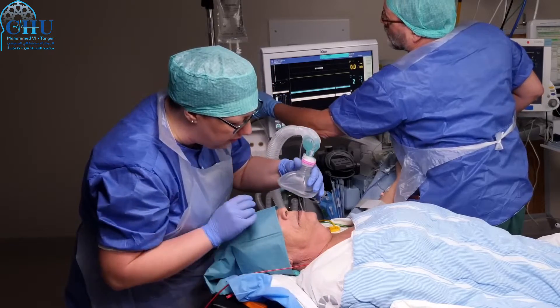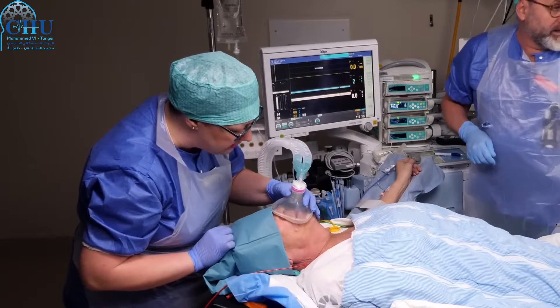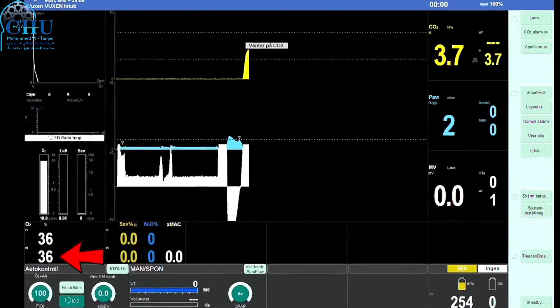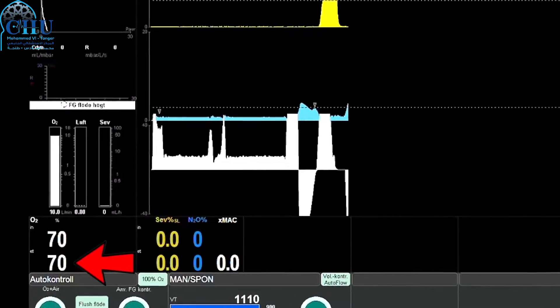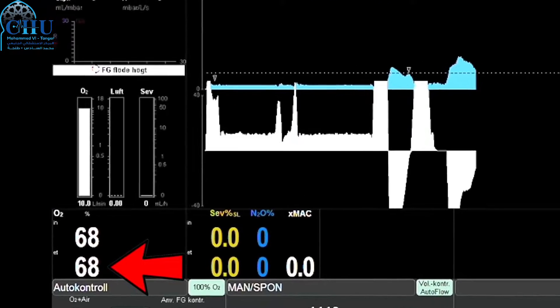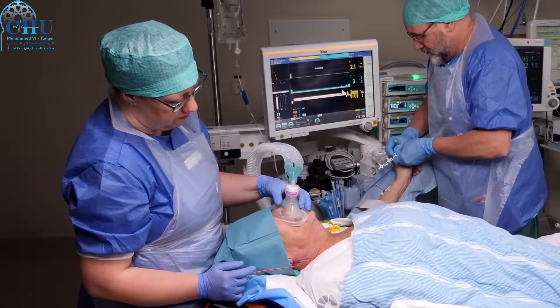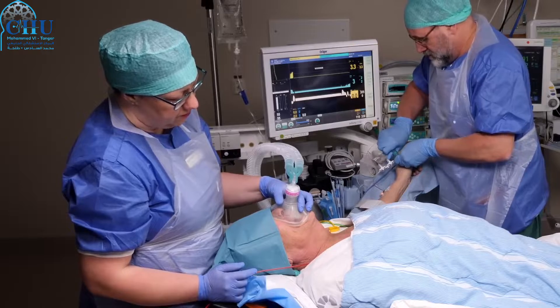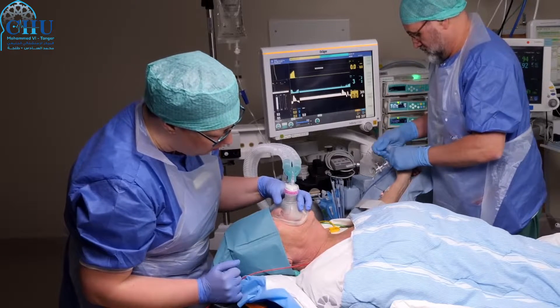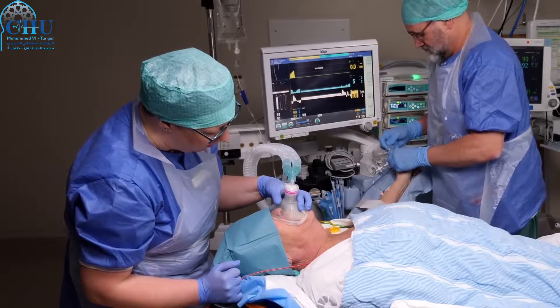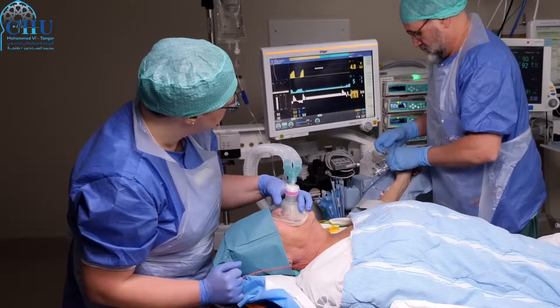Have the patient inhale 100% oxygen through a tight-fitting mask. When the measured expiratory or end-tidal oxygen concentration exceeds 80%, you've loaded up an oxygen reserve in the periphery of the lungs. If this monitoring is unavailable, pre-oxygenate for a minimum of three minutes.